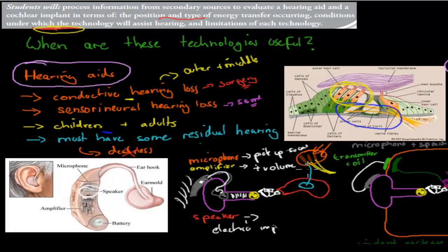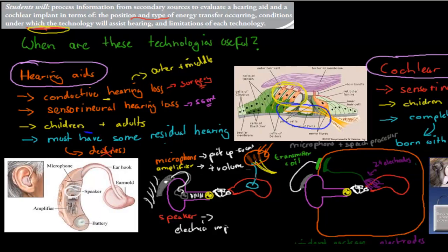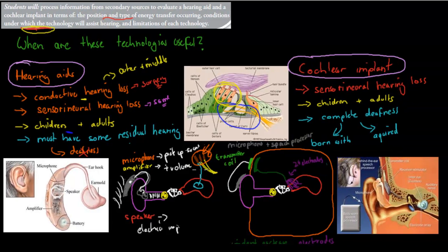It might not be forceful enough to be able to move it properly, right? But because of the hearing aid, even if those hairs don't move or aren't perfectly the way they should be, that increase in volume will make it still move as it should. So it will make it move, and you'll hear a bit more. It'll basically be amplified a bit.